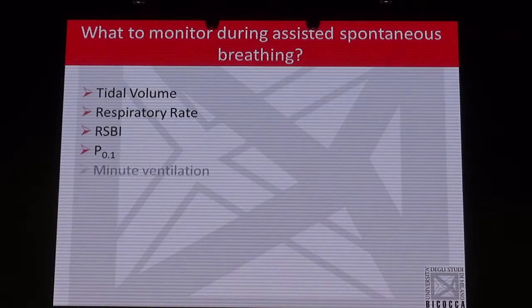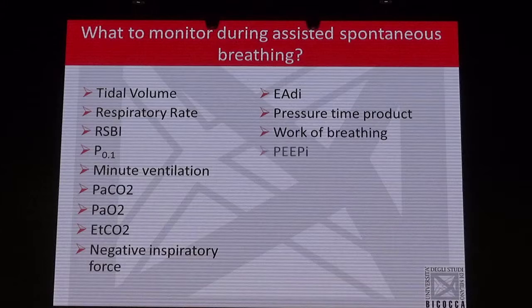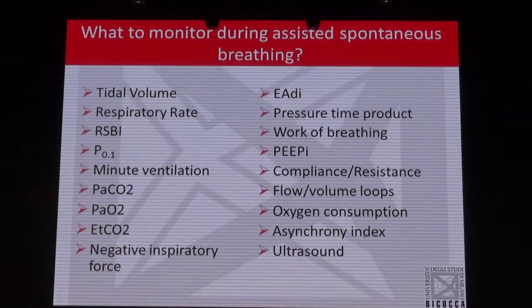So what do we want to monitor when we have a patient who is undergoing assisted spontaneous breathing? I think we have a series of parameters that we can monitor. So there are 18 of these in the list, and so I have about 50 seconds to talk to you about each one of these. That was a joke, anyway.